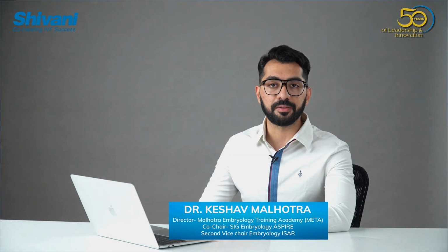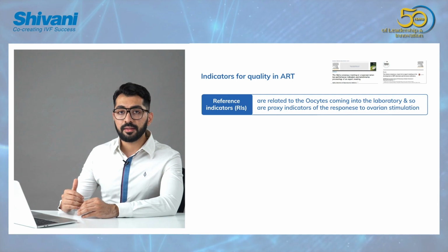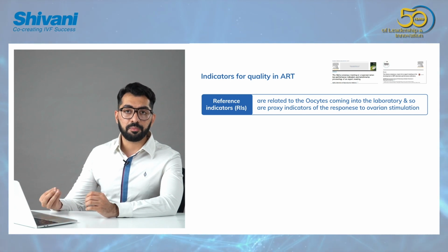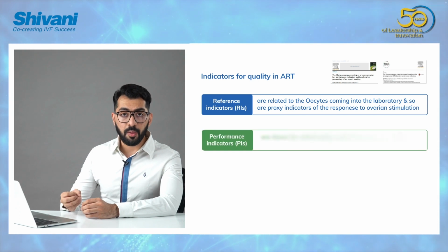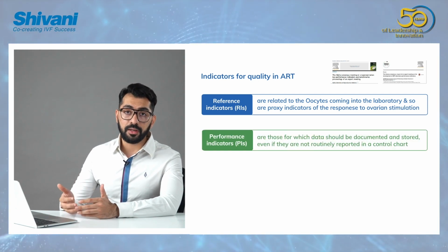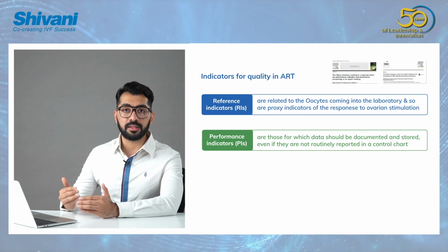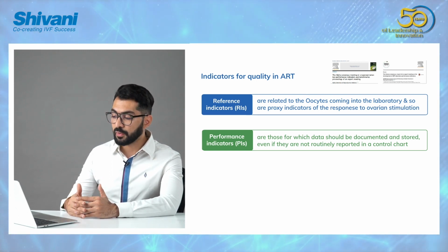When we talk about reference indicators, these are related to all the eggs that are coming into the laboratory. So anything which relates to the quality of the oocyte, we are going to basically assess it through a reference indicator. When we talk about performance indicators, it basically is all the data that should be documented within your laboratory. It's not necessarily that you're going to really assess this data on a day-to-day basis, but this is something that you would want to document within your laboratory and store this data for later use.